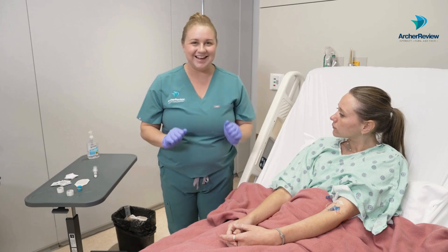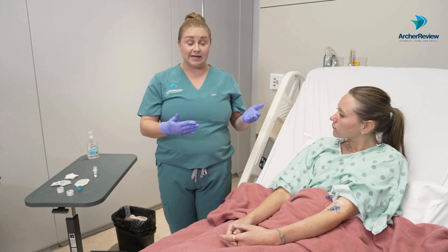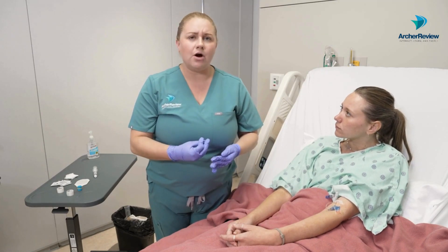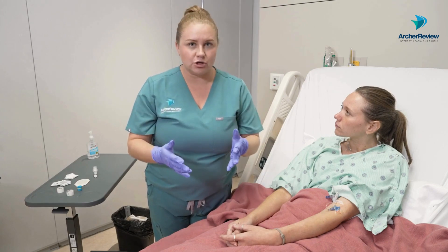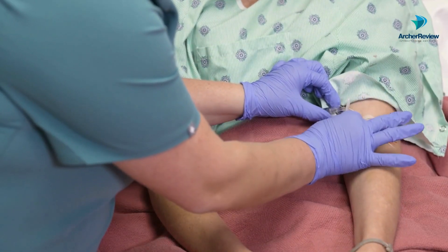I've already done that, so let's get to the good stuff. Step one: removing the old dressing. This Tegaderm is looking pretty gnarly — I think it's going to peel right up. If you've got one really stuck on, there are products in many facilities that help remove that adhesive, so make sure to look for those if they're needed for your client. Here, we're just going to go ahead and peel back this tape.